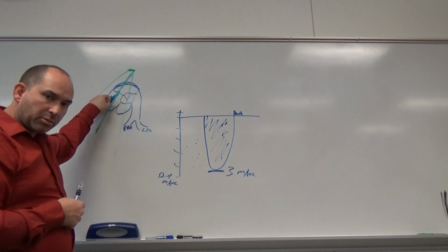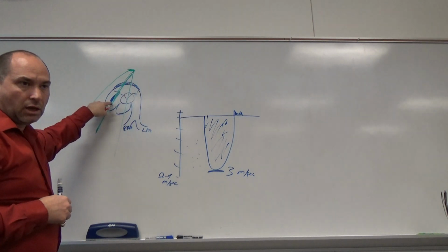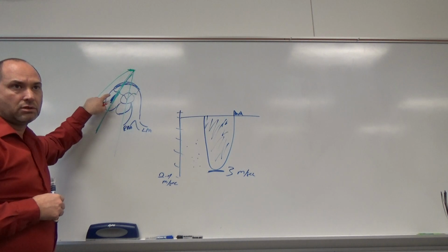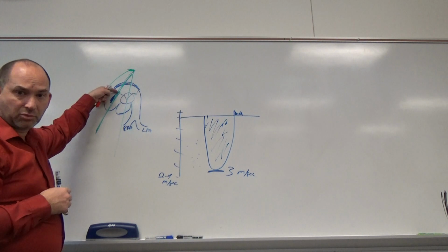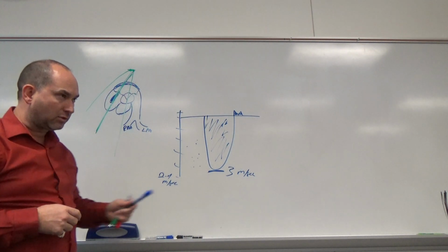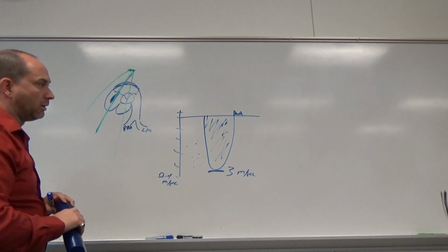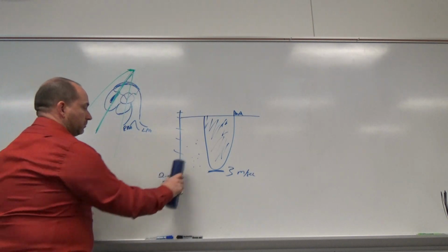So we take a 2D clip of the sector size down over top of that. Then we stick color Doppler on it. We take a color clip of that, and we want to see the extent of that jet, but I have to see where it's coming absolutely through the tips of the leaflets. Then we've done what we need to for tricuspid valve. If there's a stenosis, we can go and optimize for the inflow of that and do some measurements on that. But we're not going to worry about that very often because tricuspid stenosis is not that common in adults.